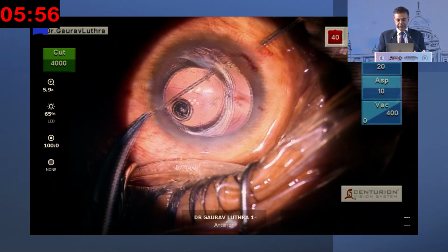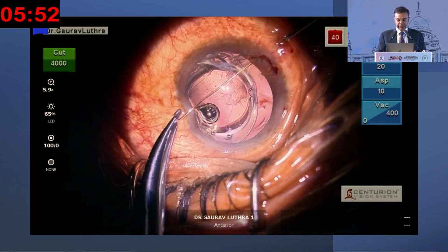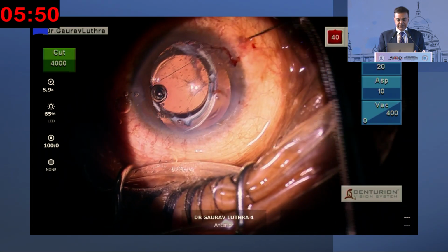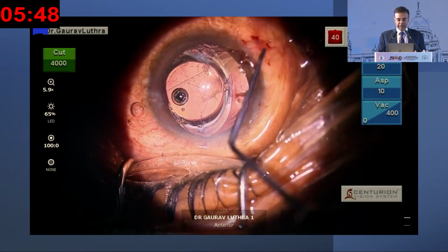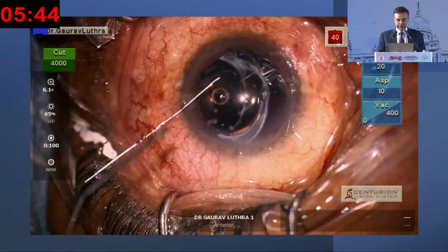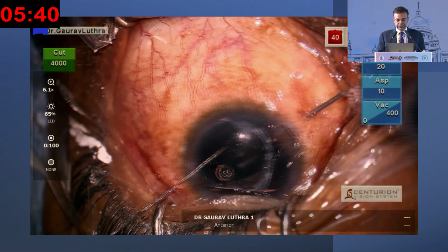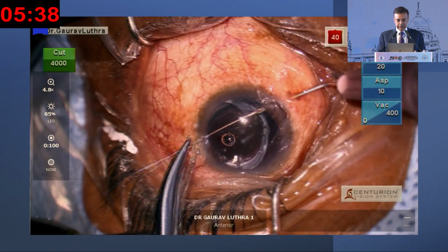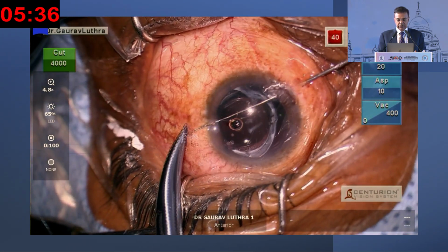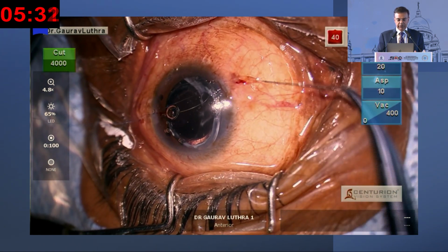It's pretty straightforward. As you can see, I've passed the Prolene needle and railroading it into the bent 26 gauge needle. One suture is out of the Hoffman's pocket, and then I'm going to pass the second suture, and there goes. And once they're out, you will essentially have to just retrieve the sutures from the pocket.